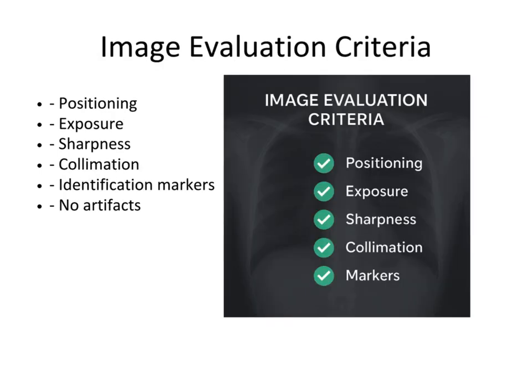Slide 9, Image Evaluation Criteria. Every radiographer must evaluate an image before approval. Check for proper positioning, adequate exposure, sharpness, correct collimation, and presence of patient identification markers. A good radiograph is free from artifacts and shows all required anatomy clearly.